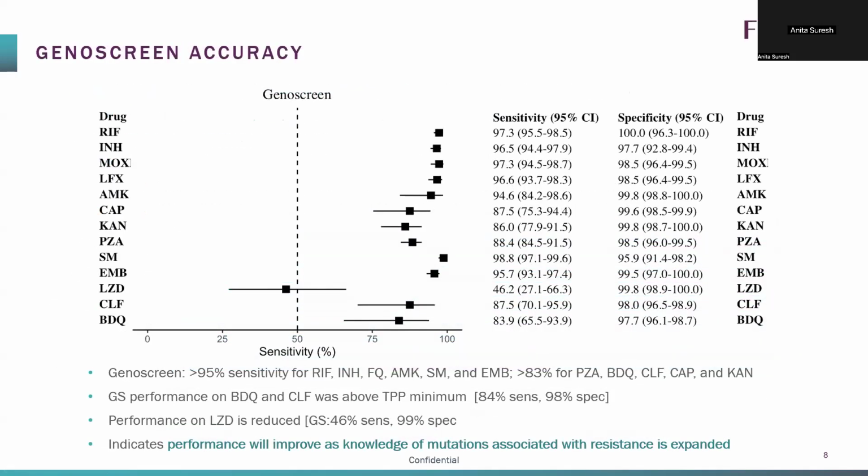So I think this is more specifics on each of these assays. Again, you will see these results in the WHO GDG results as well, the entire policy document. If you're interested, you will see a lot of good data in there. This is, again, a quick summary to tell you exactly how these products performed.